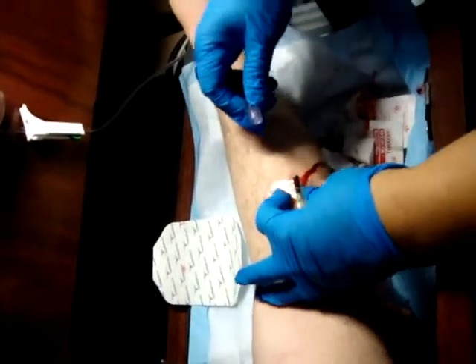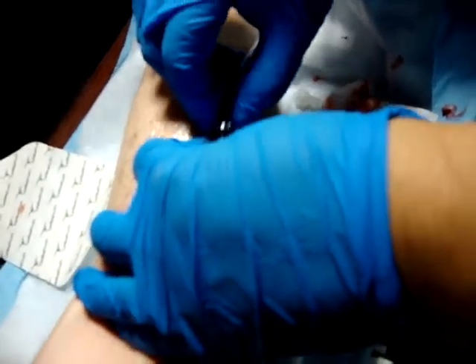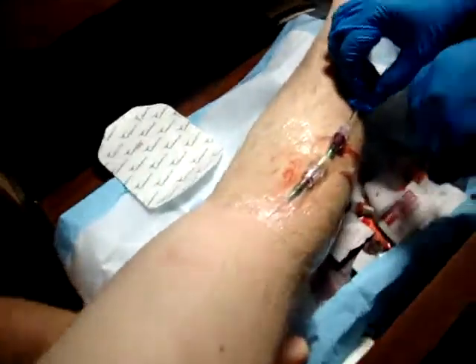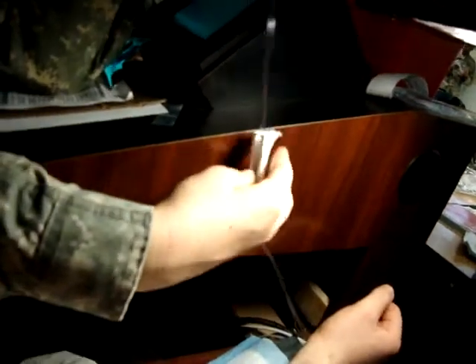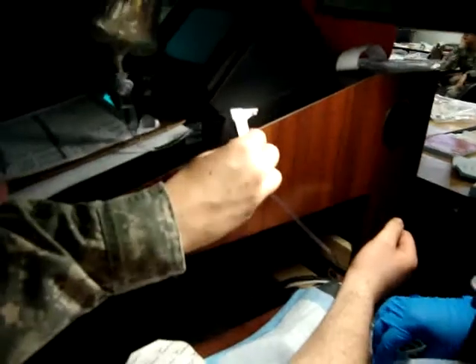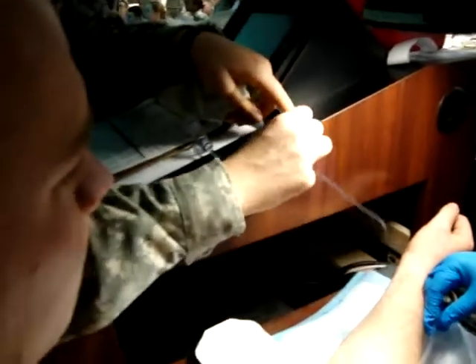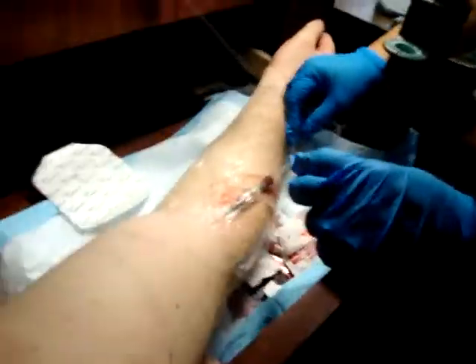Grab your tubing. Grab the hub. And twist it in. Now you can go ahead and open up the flow. Open up the flow. Hold it up. And he should be dripping.